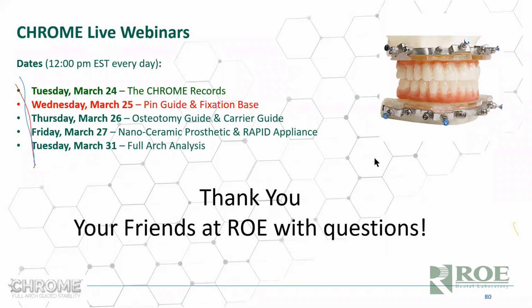There's a question here on denture alone with foam. What is this? Okay. Whenever you do a dual scan technique, if you take the denture out of the patient's mouth and you just put it in the CT scanner, many CT scanners have a plastic chin rest or plastic plate. And if you scan the denture on that plate, the denture and the plate merge.